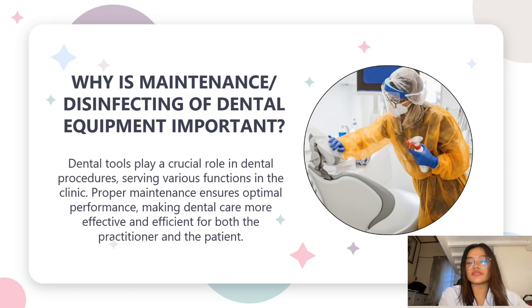First, let me discuss why keeping dental chairs and equipment clean is so important. Why is maintenance or disinfecting of dental equipment important? Well, keeping dental equipment clean and well maintained is crucial because it ensures a safe and hygienic environment for dental procedures. Proper maintenance prevents the spread of infections, promotes efficient equipment performance, and contributes to the overall patient well-being.